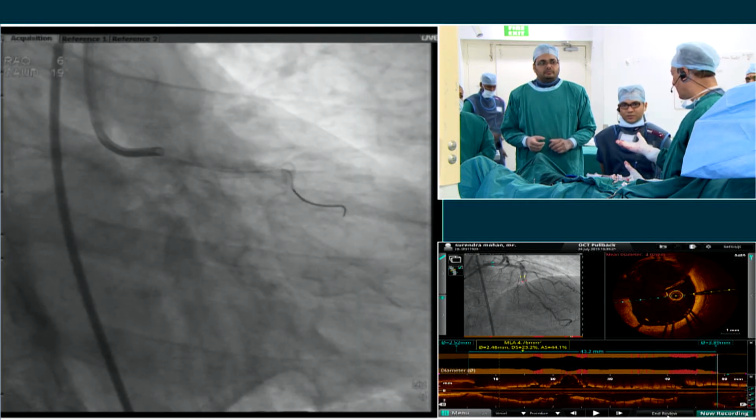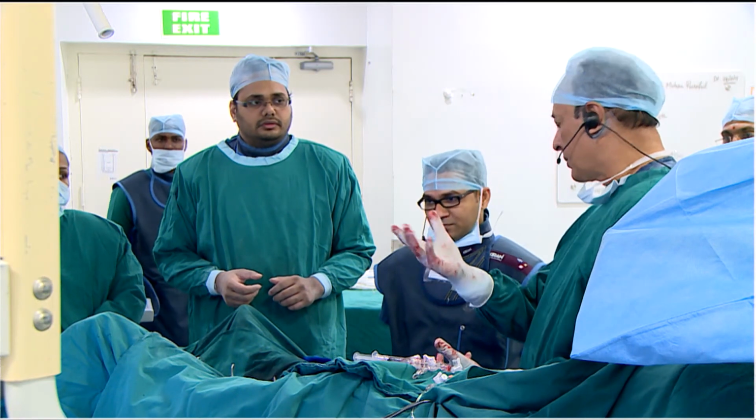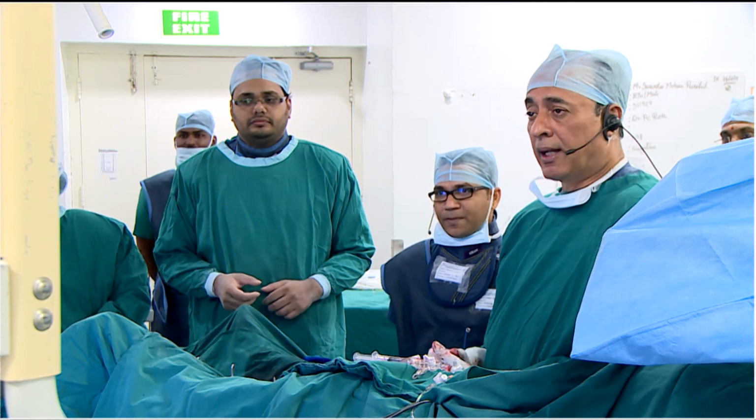Now with this DK crush technique and all that, I think that's the end of it.